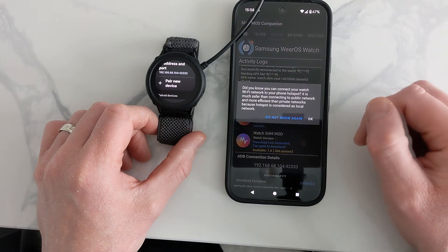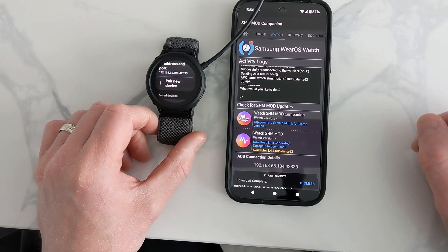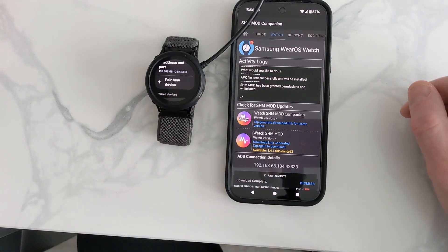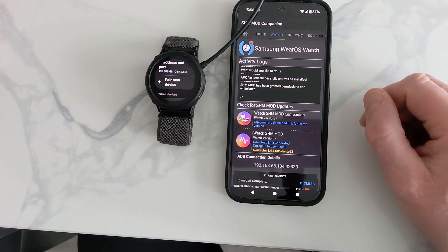Press OK and it will start to transfer and install that app to the watch. Just let it go. It has granted and whitelisted the app — sometimes it might not, depending on your phone you may have to scroll further down the screen to do that, but it's done it here automatically.